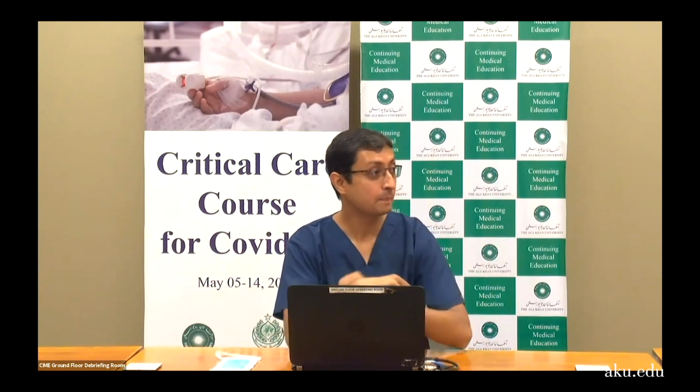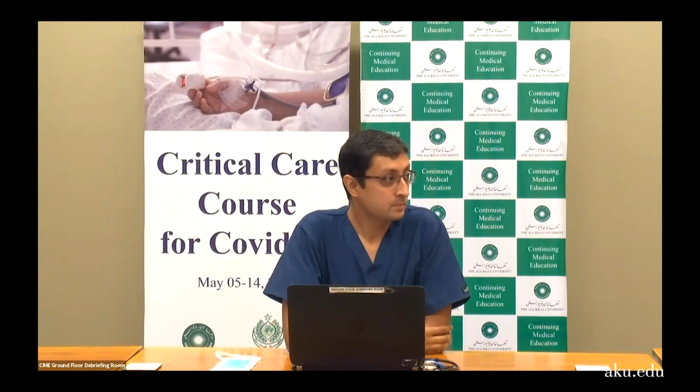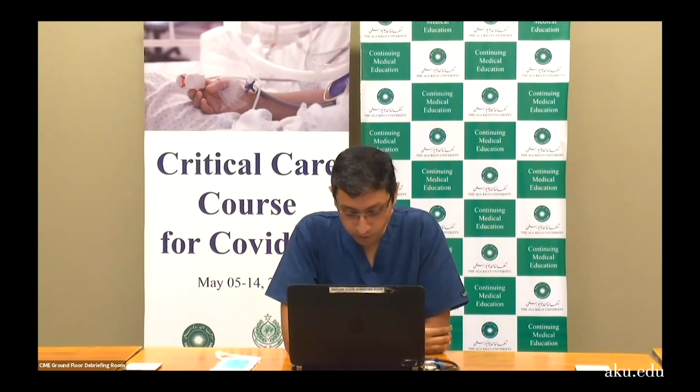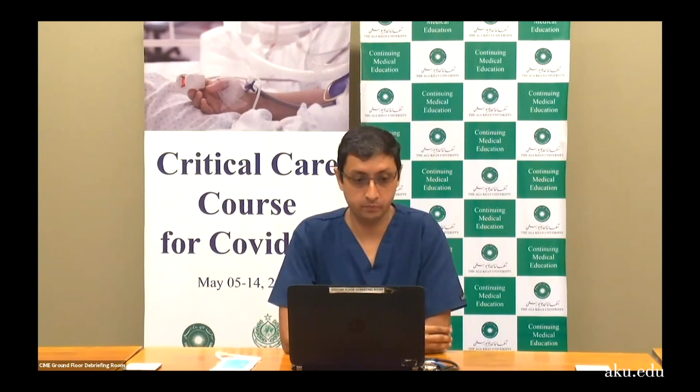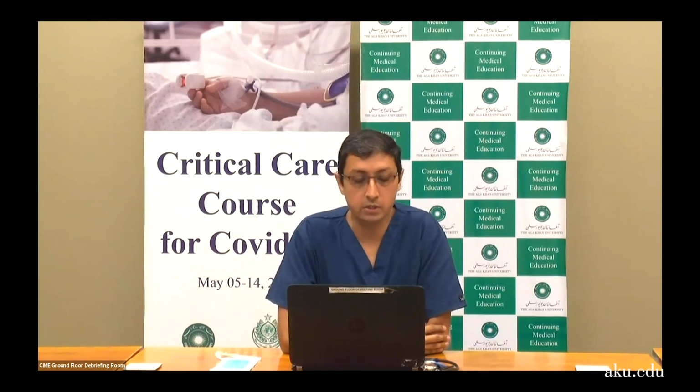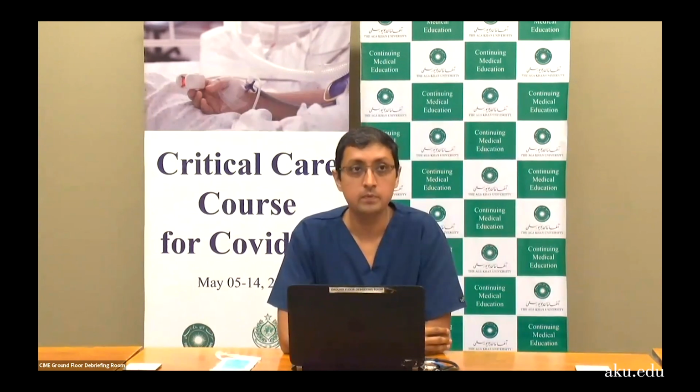Okay, Dr. Fajad. Next question: what type of vent mode in ARDS for a COVID patient? Right. So it doesn't matter actually what to start with. The thing is that you need to be safe. If you don't understand anything, you can either put pressure or volume.